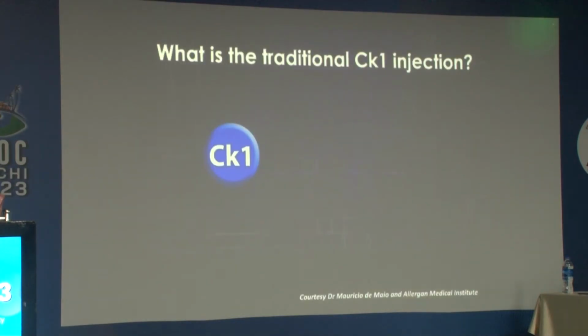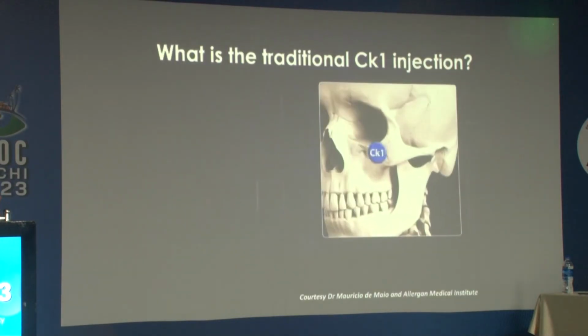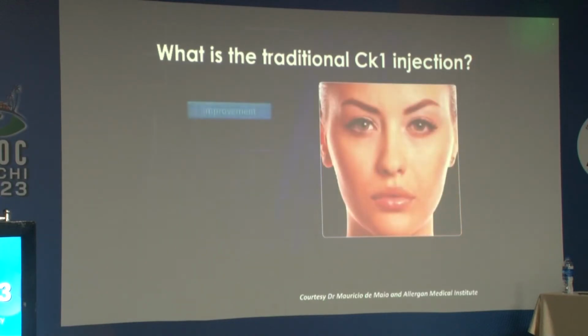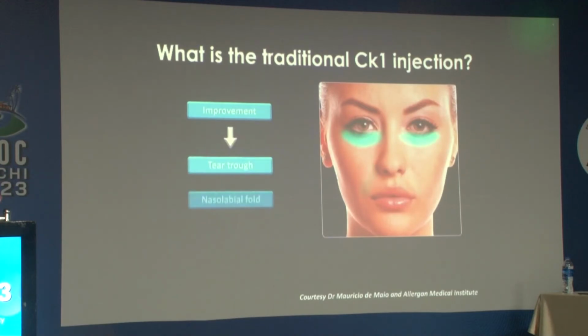We use this for a facelift, but for the facelift, I just want to show this animation. This is the most important point where you inject on the zygoma, because this is the most important point which many of the plastic surgeons call the G point. So if you give the first injection, there are different ways: either you give a single bolus or 3 aliquots.